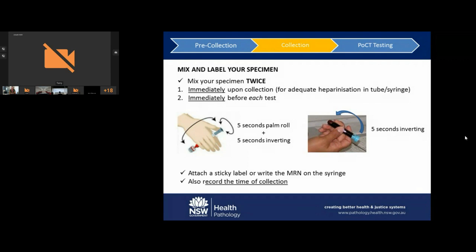The other thing to do with your specimen is to label it with the patient ID and the time of collection. This helps prevent two major issues, knowing which specimen is yours amongst the pile next to the machine and ensuring the specimen is run within the specified time frame.